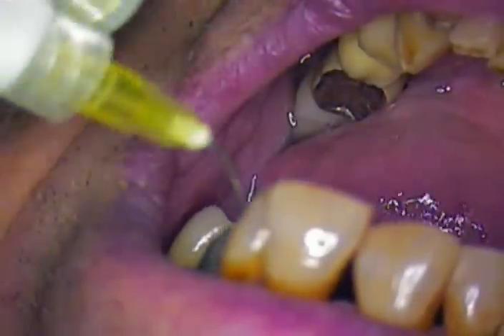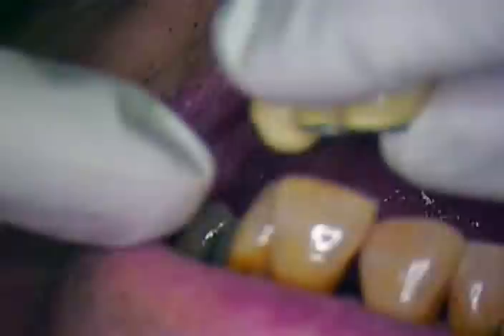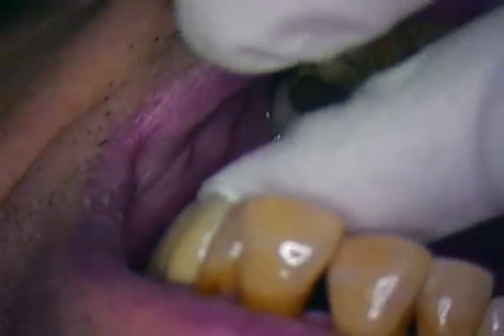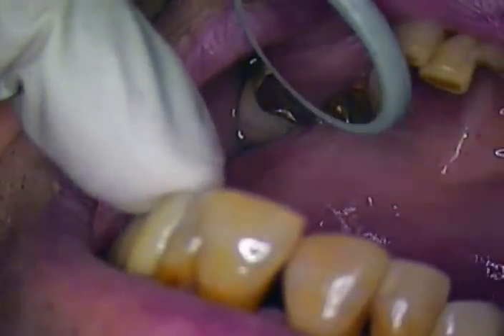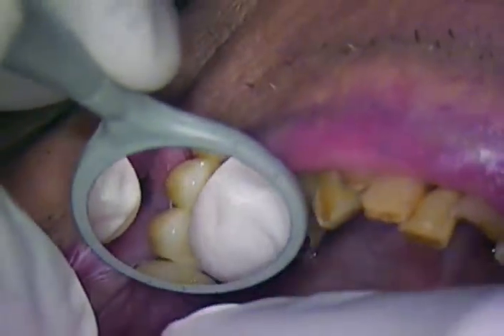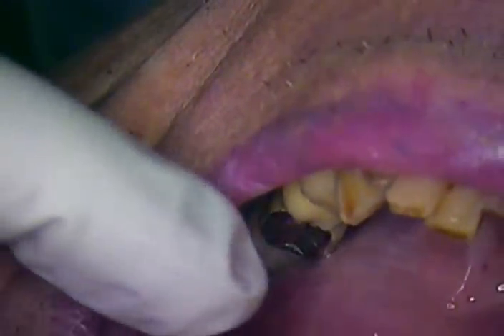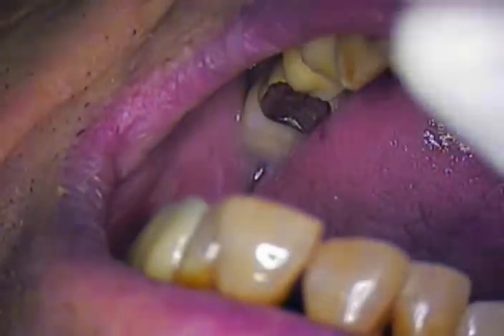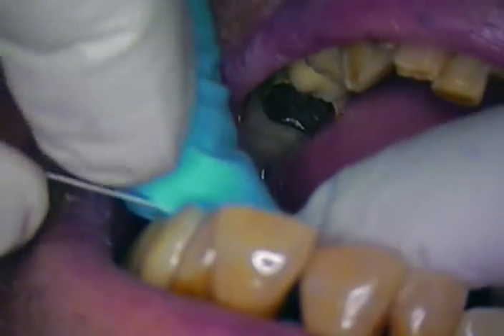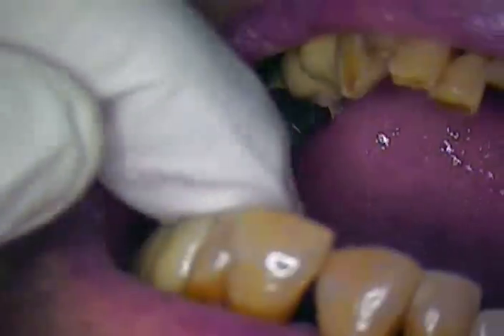Right now we're not ready to cement — we're ready to try in the fixed prosthesis and check the contacts. We're going a little lighter with shade, anticipating later on either bleaching or lightening the front teeth. I'll check the contact — there's a little shredding there, so we'll adjust for that. And this still snaps nicely without any shredding.